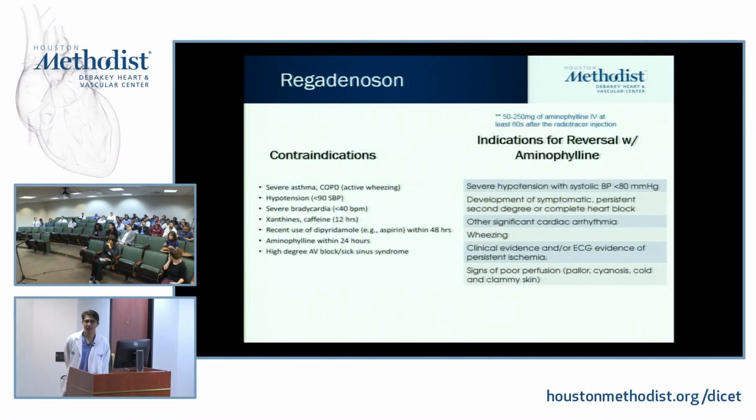Yeah. When you said 1 minute, I was always told to wait 3 minutes. That 1 minute would be too soon. Okay, that's a good question. At least from my reading, and from what I've seen, you can do it up to 60 seconds after the radiotracer. Sure, the more time you have for the radiotracer to be deposited before you reverse the agent, the better. But if you see a very critically ill patient, they're not looking right, you're going to give it sooner rather than later. The longer you wait, the more you're allowing radiotracer to be deposited in relation to flow.